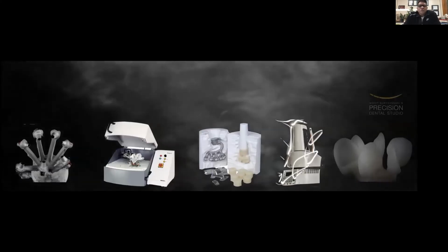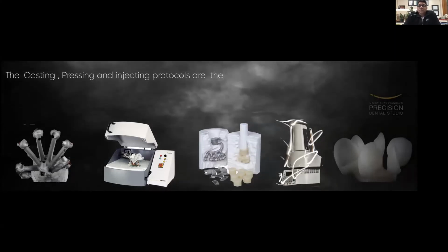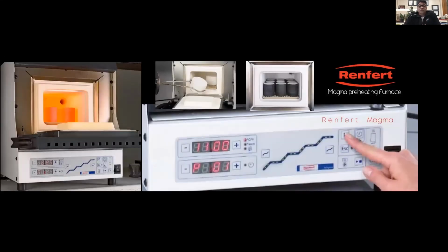And most importantly, like all these factors, whatever we are fabricating in the lab, the casting, pressing, and the injecting protocols are the most important, but they still remain underestimated. We don't give it the importance that it is required, because these are the factors that make your restorations, that's the base of the restorations.